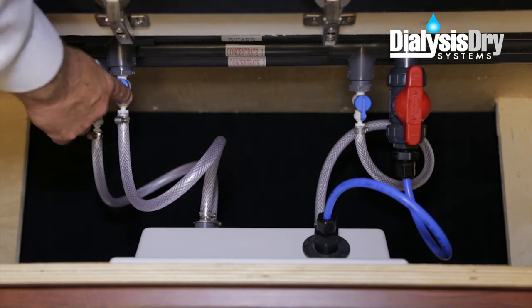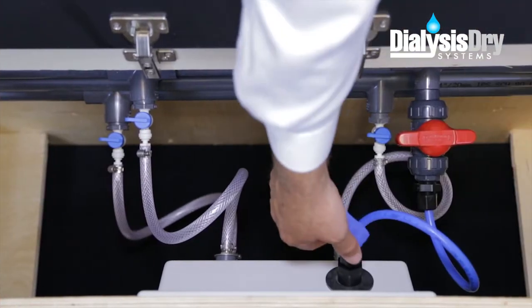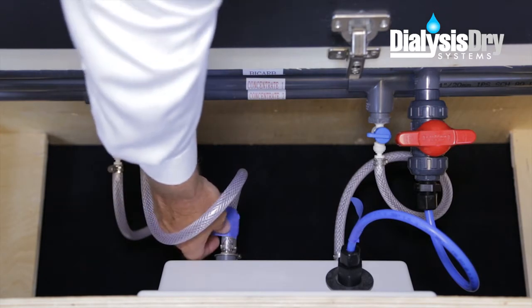You'll find them here, here, here, and here. Then, label each of the tubes for reinstallation, so you're sure each tube will be connected to the right port.